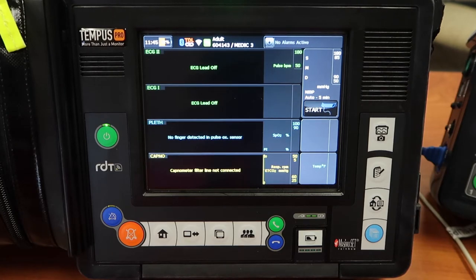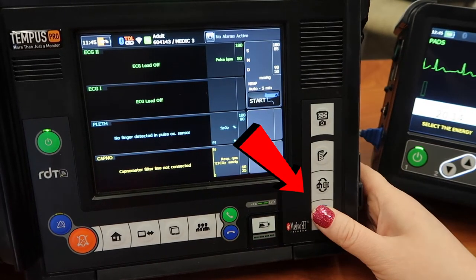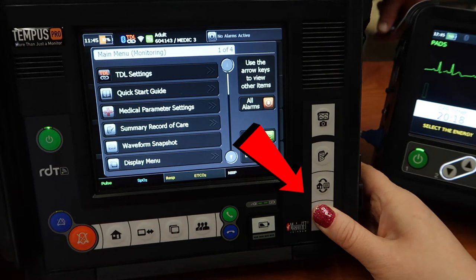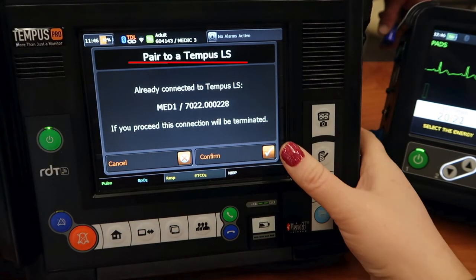You'll see the cardiac monitor right here, and I'm going to press that blue button which is the menu button — but I don't just press it, I actually hold it down. As you can see it's already connected to something else, so I want to press confirm and that way it will stop pairing with whatever device it was connected to originally.